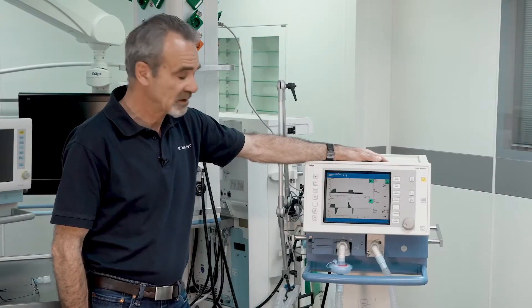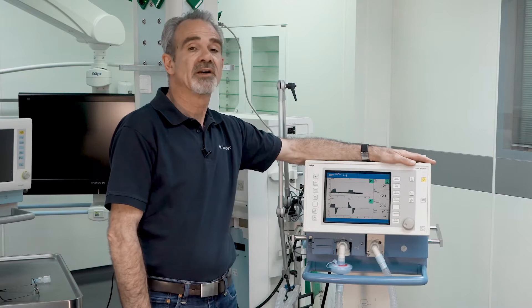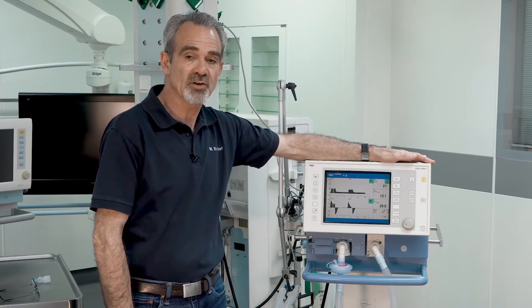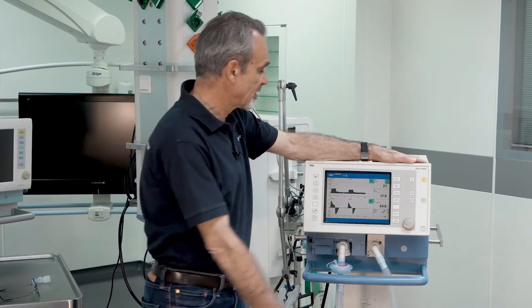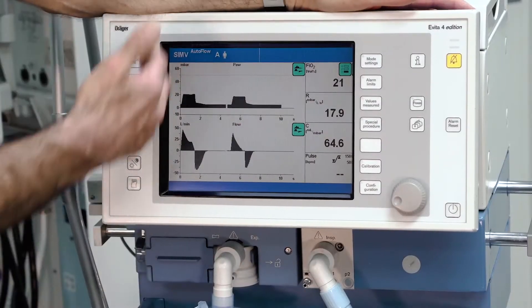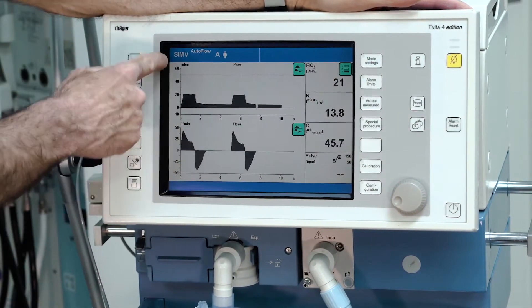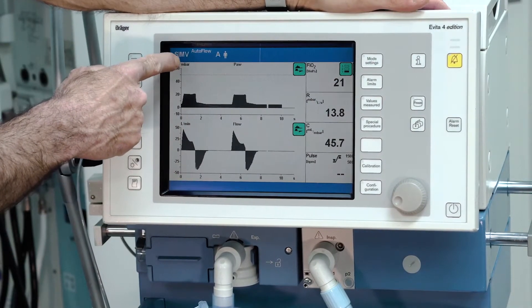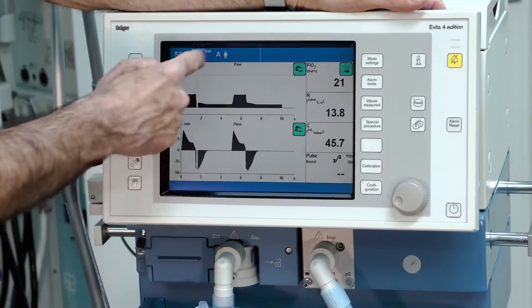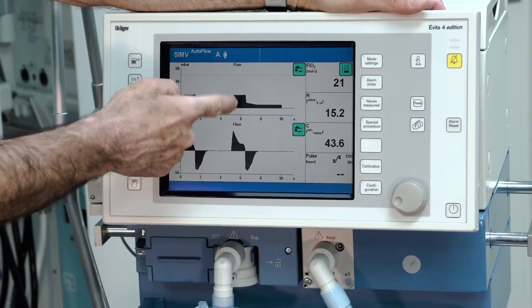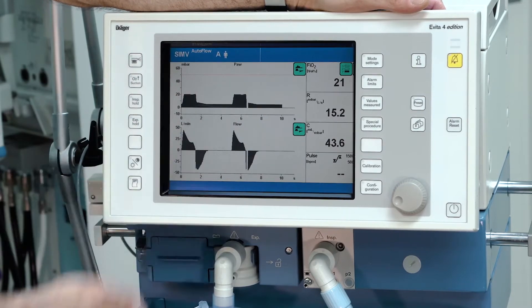The ventilator starts ventilation in the selected ventilation mode and the selected settings. On the display, you have in the header bar the actual ventilation mode. Below, you have in this case the pressure curve and the flow curve.